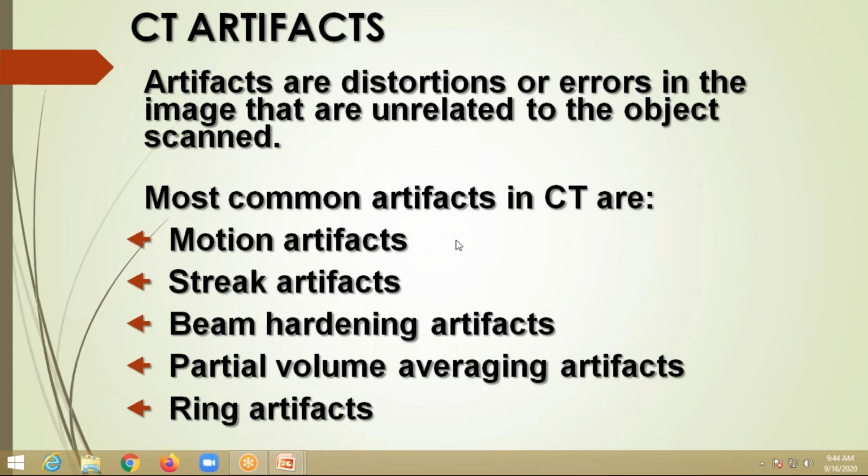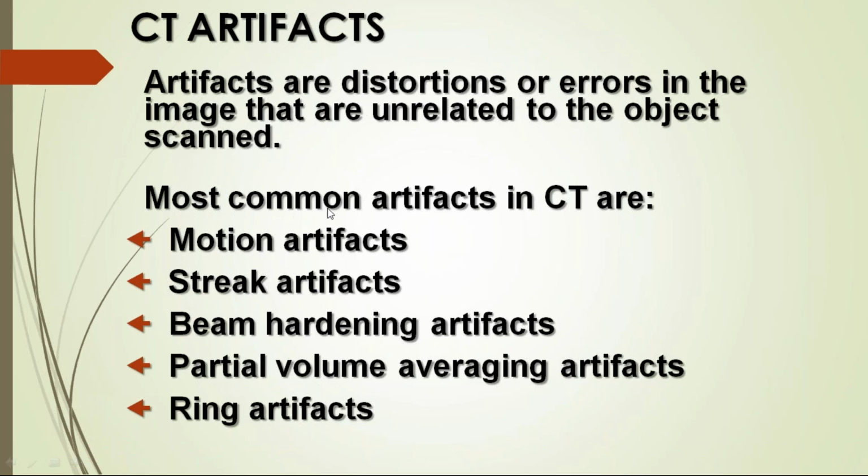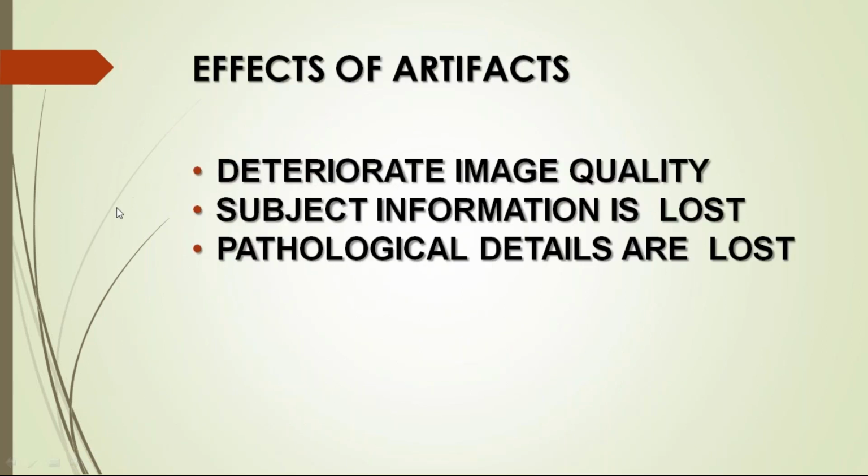Okay, coming to the motion artifact, I will tell you the effects of artifacts. They deteriorate image quality, and then subject information is lost.